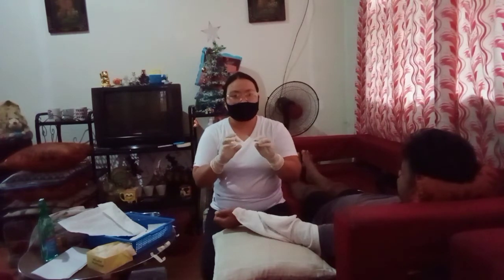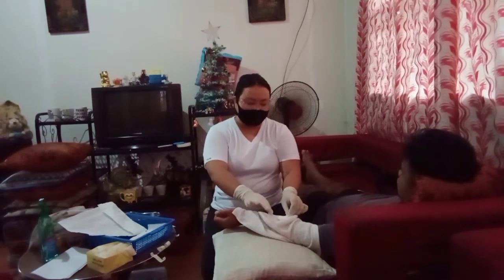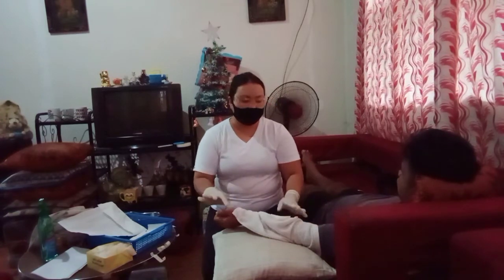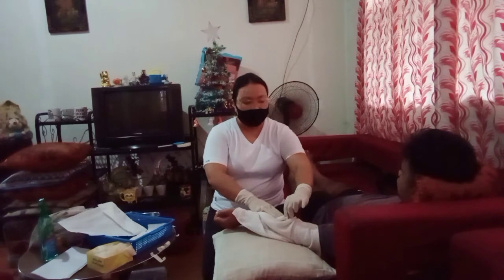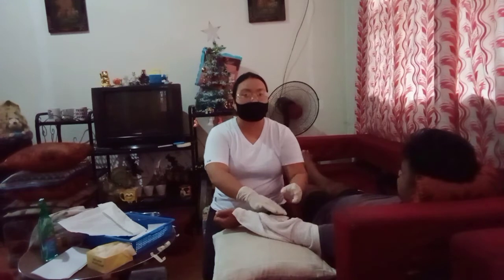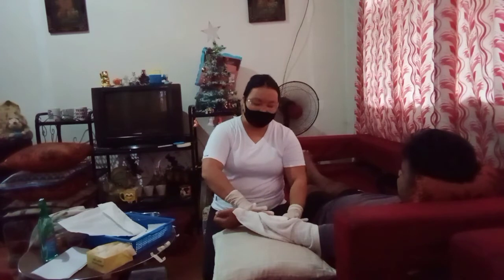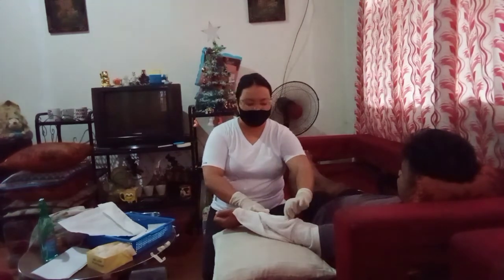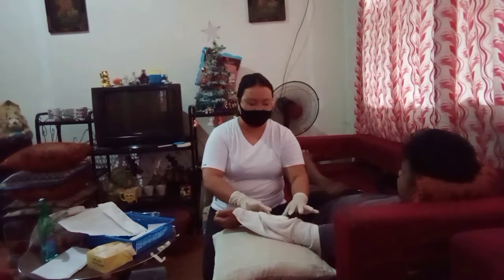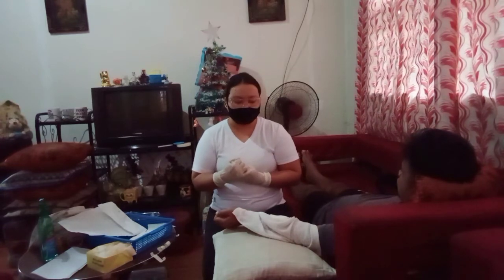And then after it is wet, you put dry gauze over it to cover, while the moist gauze stays inside the deep wound. Then tape it. And that's all for the deep wounds.